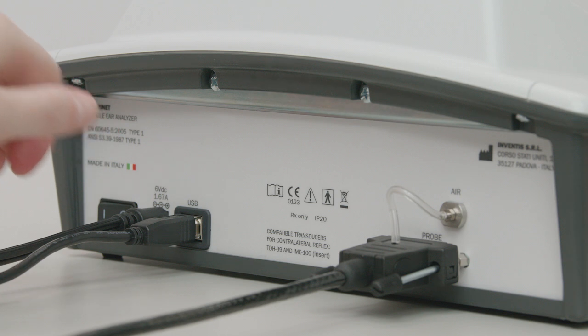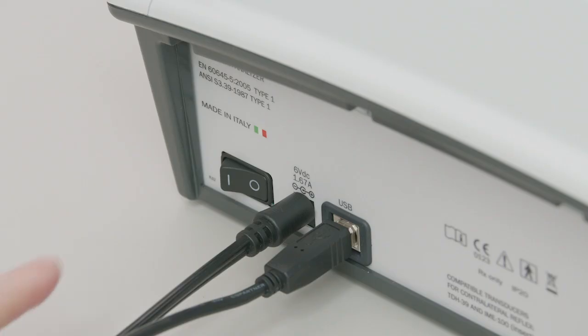Once all cables and leads are connected, the instrument can be switched on from the rear panel. A few seconds after powering on, the instrument's display will show on the main screen.